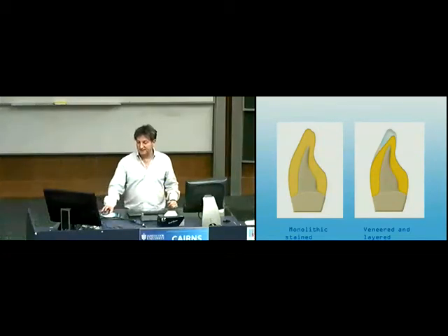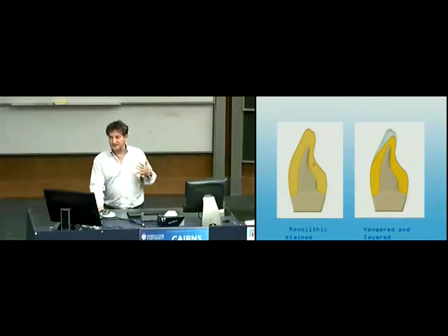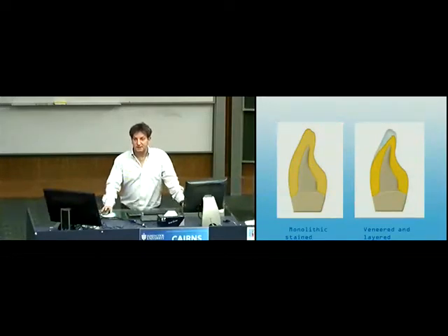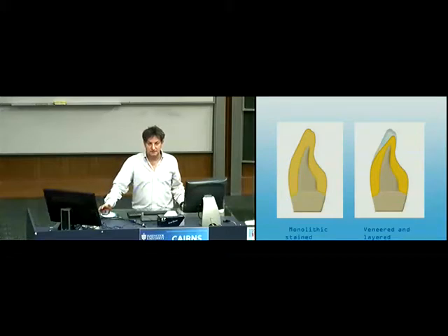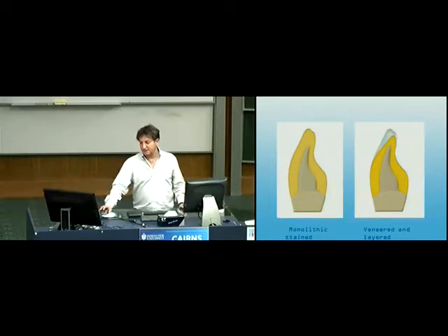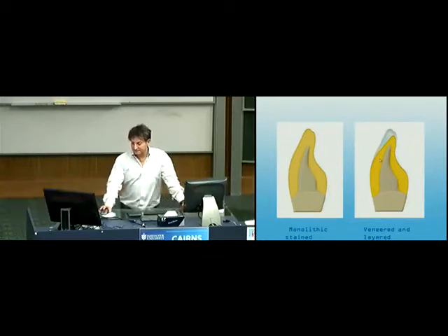So over here on the left-hand side, the monolithic restoration, this is probably where it's all heading. Why is it heading there? Because machines can make monolithic restorations. And I'm going to show you a milling machine and how it works. Is it good? It's not bad. But there's still a lot of problems with milling. Some of them are a little bit more difficult to circumvent than others.